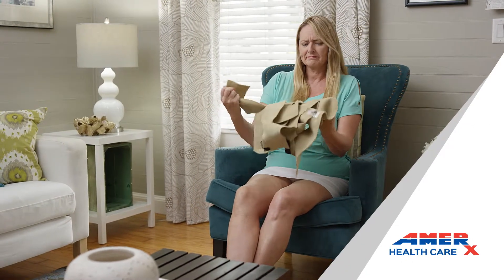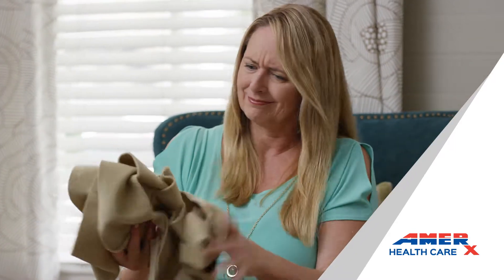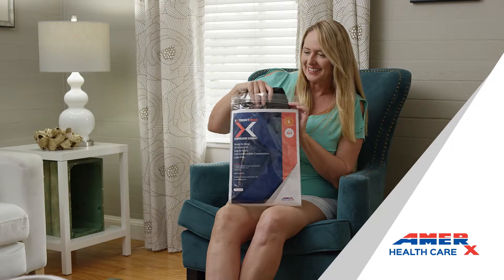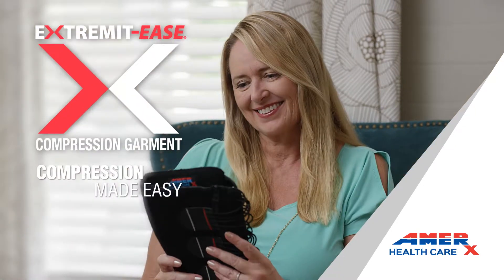Are you tired of struggling with hard to apply, uncomfortable compression garments? Enjoy compression made easy with the Extremit-Ease compression garment.